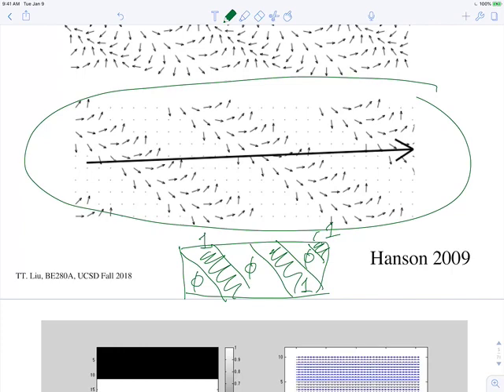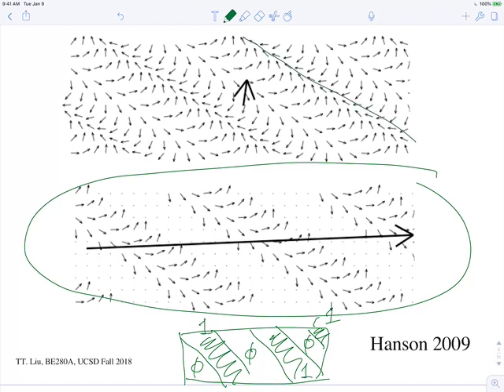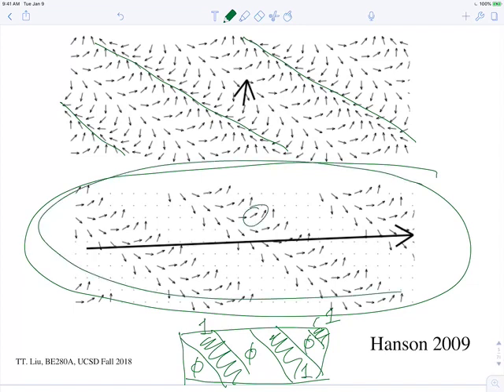And now we look at this object. This object is a fairly good match. Remember, this phasor pattern is this. And now this phasor pattern is actually a pretty good match for my object. So when I sum up all these spins, the spin here that could have canceled them out is gone now. So this value, g of kx, ky, is now going to be a big number again, because my object is a good match for my spatial pattern.